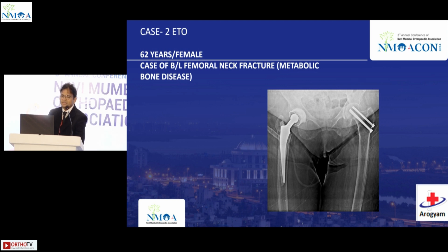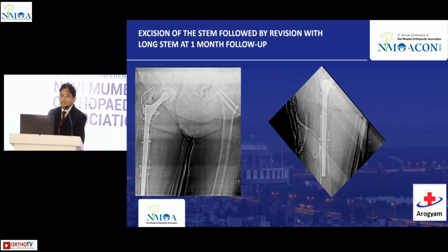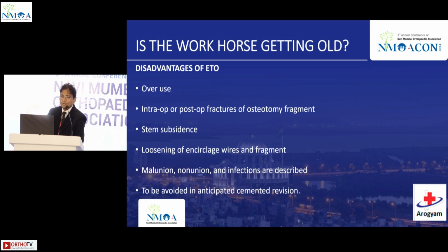This was another case. These are our own complications. And what Ashish just told, that in a fused spine the version has to be less. So this was a mistake. We didn't do a proper study of the spine, and this got dislocated anteriorly, so we had to convert it into a long stem. So now my contention is: is the workhorse getting old, or are we using it too much in every case?